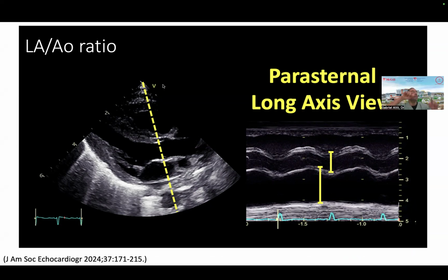You'll see that their VTI and their LVO is going to drop significantly. And sometimes we see that and we act on this to improve the inotropy, improve the heart rate. So that's why often in asphyxiated babies that are bradycardic with poor cardiac function, if we see the lactate is rising and we're concerned and we on echo have bad LV function, what medication would we use?